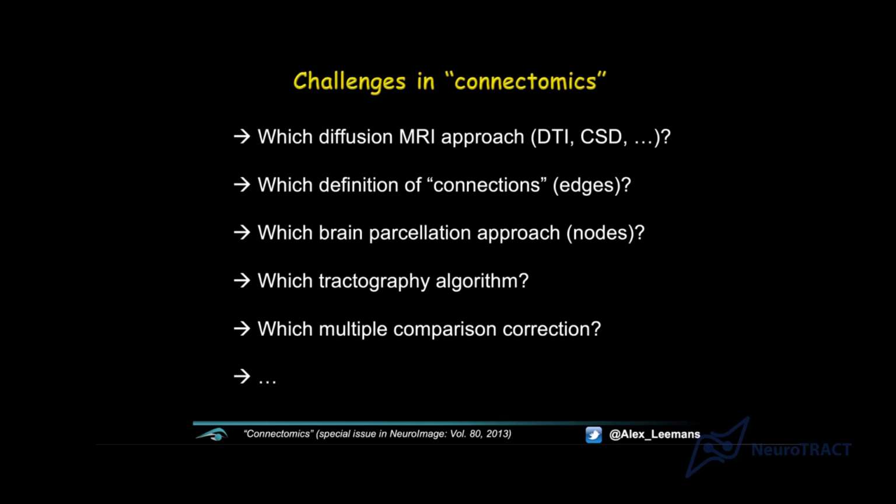And ideally you do something like a Bonferroni correction. But in practice, we always know that there's some kind of correlation between adjacent nodes and things like that. So the statistical approaches have not yet, let's say, crystallized, in my opinion.